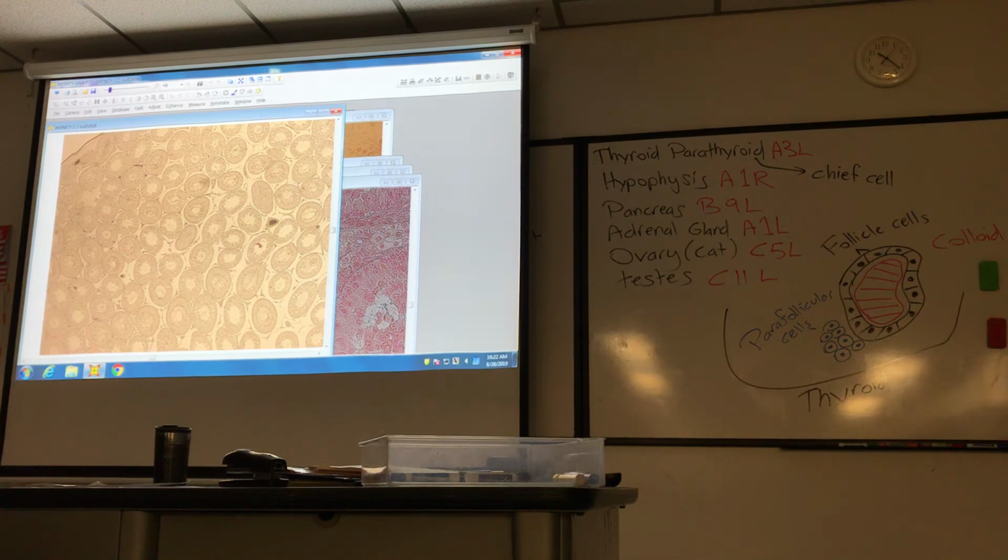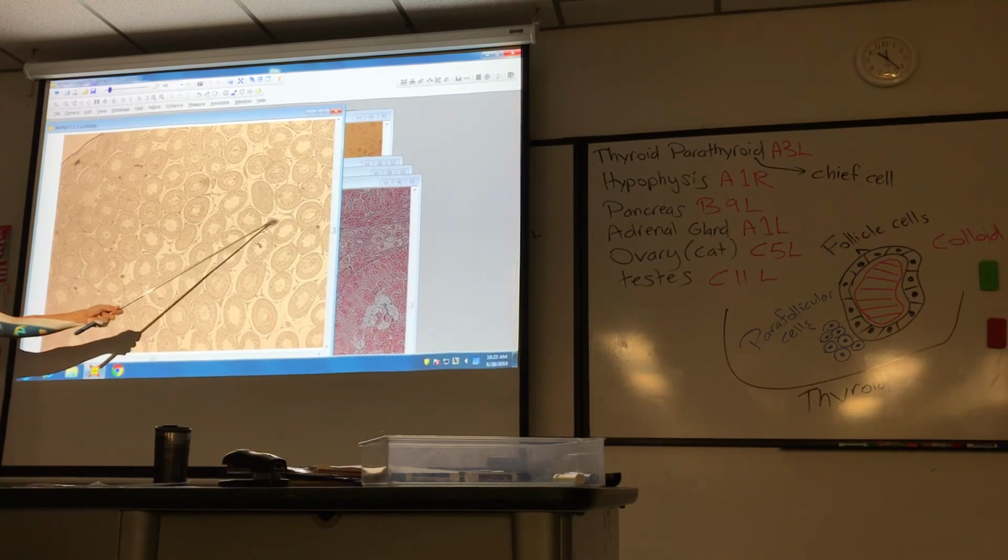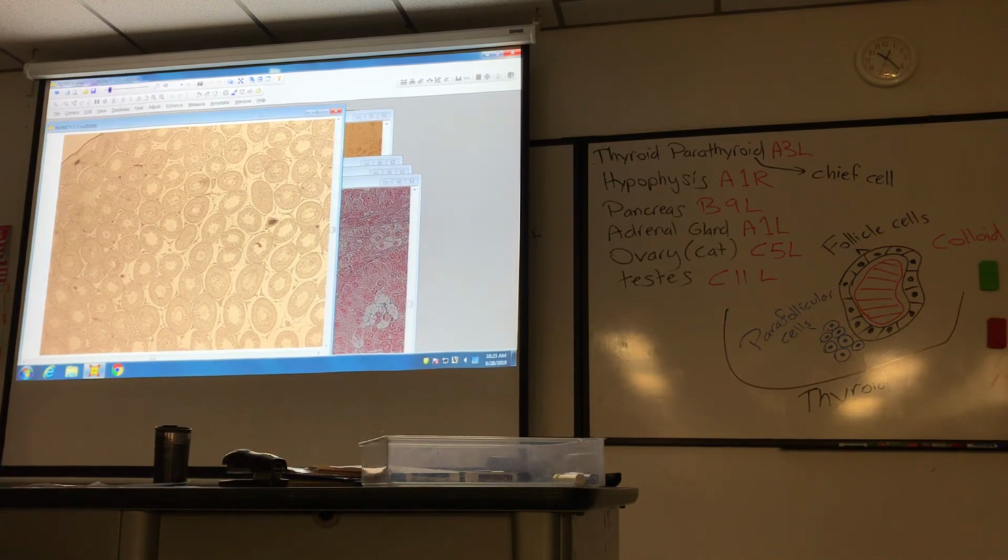So you see a bunch of cut tubes, and you see kind of stuff in between the tubes, so to speak. I mean, stuff isn't a scientific word, but seminiferous tubules, all cut. All the things in the middle there, in the interstitium, those are the cells that are like theca. They're going to secrete the testosterone, the androgens. We can even see a blood vessel there. This slide stains the red blood cells black. So when they're in the lumen and they're black, I know it's red blood cells in a blood vessel.